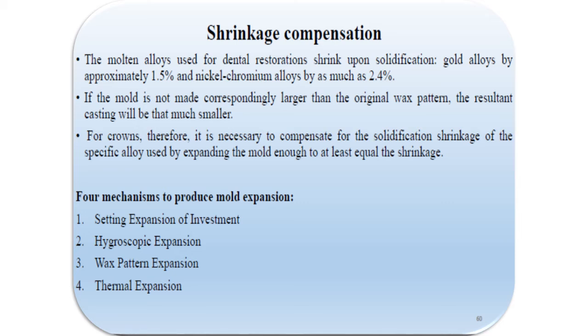So we make that molten metal flow into the empty space of the mold, and once the metal occupies the empty space in that mold, it slowly starts to settle down, the temperature cools down, and every molecule in that space starts re-establishing the interatomic distance as well as the repulsion. In this process, the metal shows some amount of shrinkage, that is called casting shrinkage. This always happens with the metal.